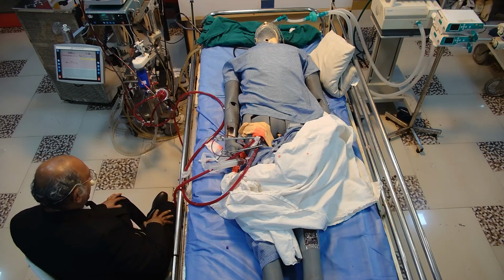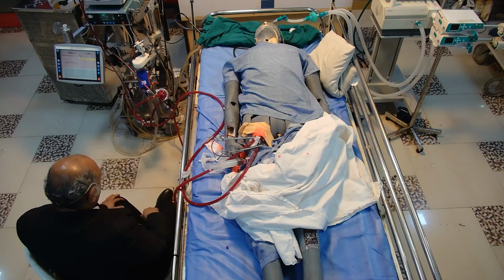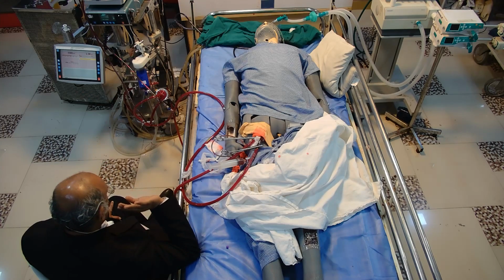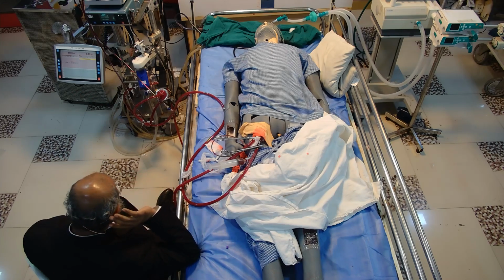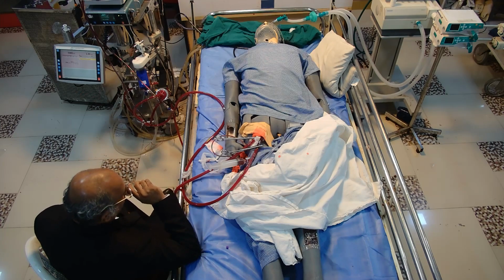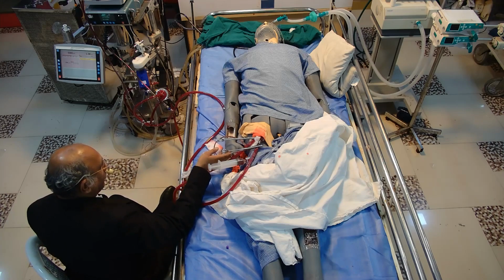You cannot keep the trial off, or you cannot keep the patient on very low flow of 1 liter, for a longer time, because there is a risk of thromboembolic phenomena. At the same time, you are in VA ECMO, so the emboli can go to the systemic vessels and can give rise to either CVA or gangrene. So you have to be very mindful about that.